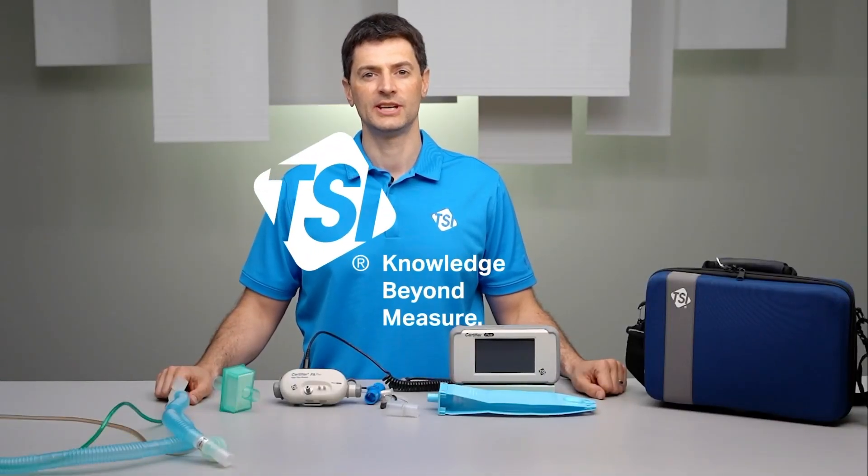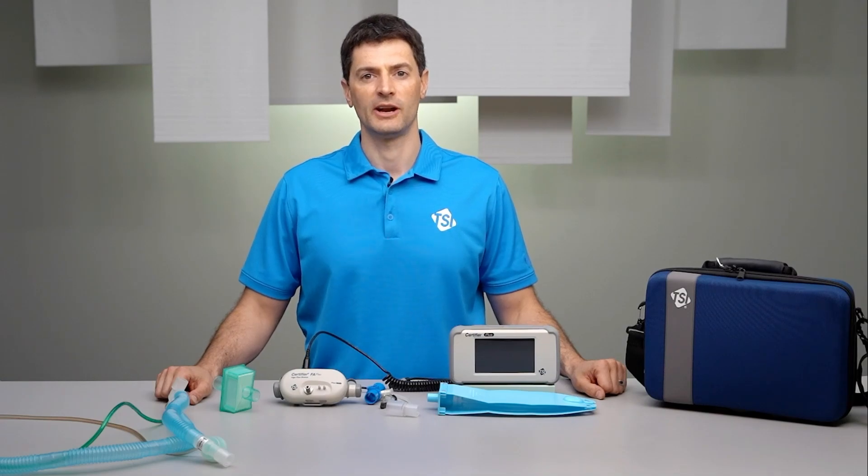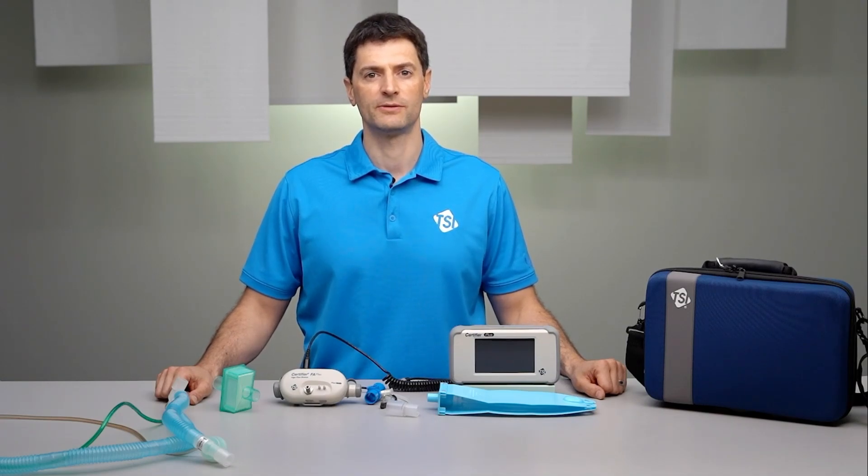Welcome to a training video on TSI Certifier Flow Analyzers. In this video, I'll demonstrate how to connect the Certifier Plus Flow Analyzer to a ventilator for testing.